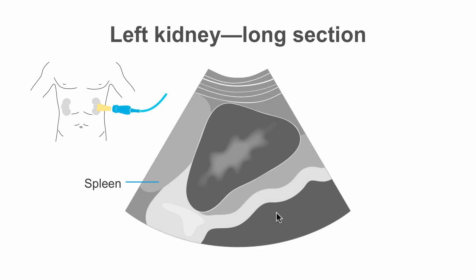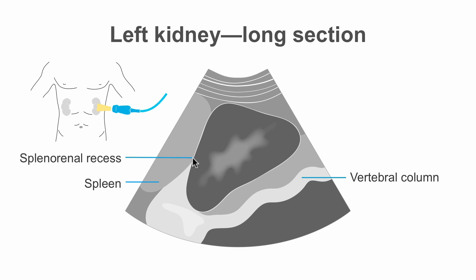We can see the spleen and the vertebral column. Between the spleen and the left kidney, we will see the splenorenal recess. Just like in examining the right kidney, we can see the psoas muscle underneath the left kidney.